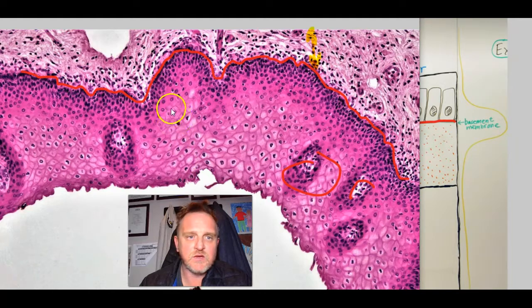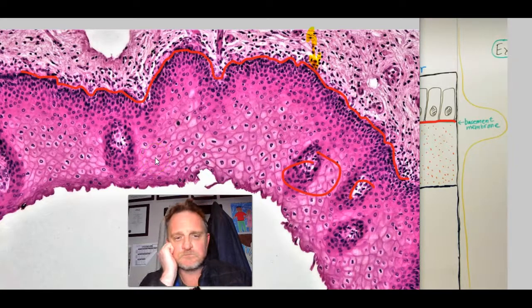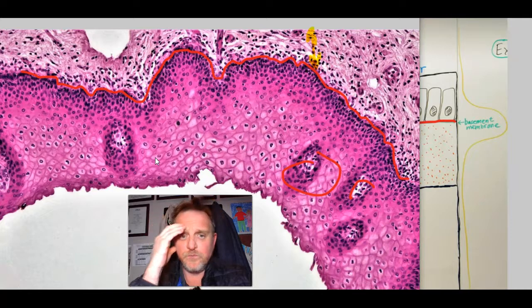It is stratified. You can see lots of, many, plenty, however you want to language it, squamous epithelial cells. The basal layer of these cells is the progenitors, the origin cells of this epithelium, and then they mature towards the superficial layer. Now, with stratified squamous cells, this epithelium is classed either as a dry epithelium, some textbooks refer to it that way, or a moist epithelium.